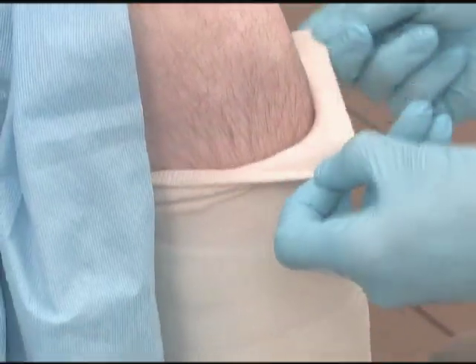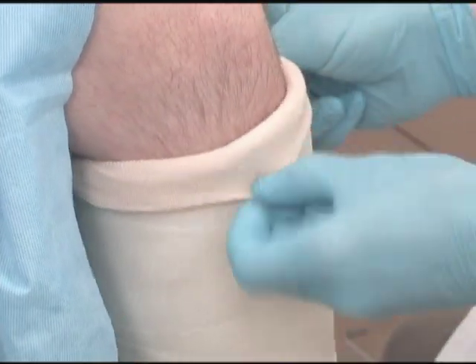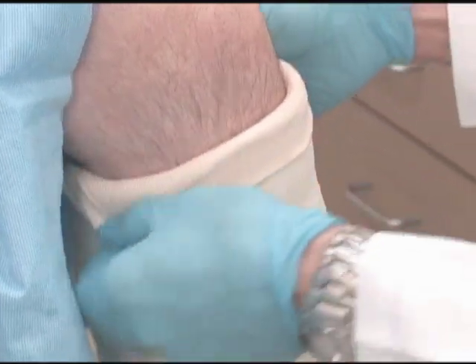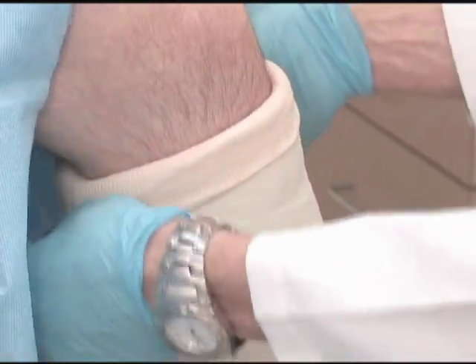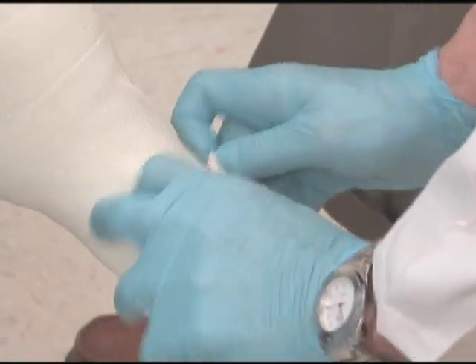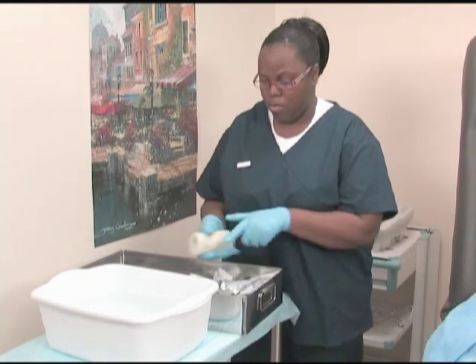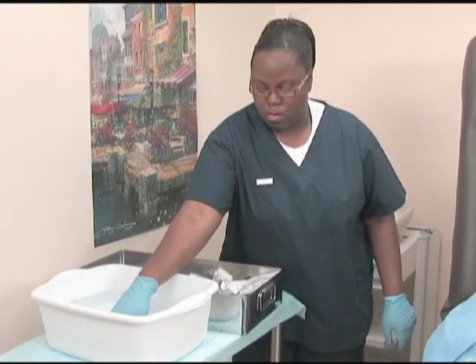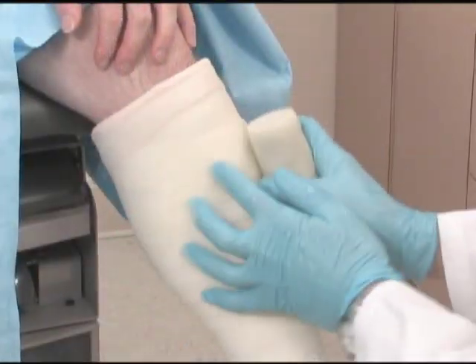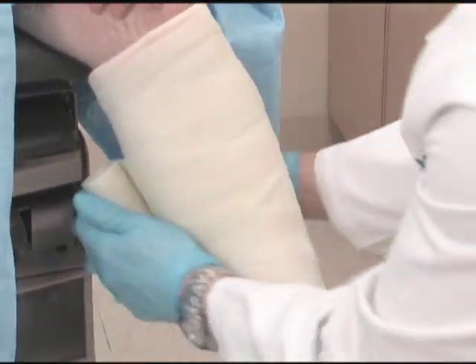When the inner cast is complete, you or the physician will roll the excess stockinette over the edges of the casting material to form a smooth edge. Open another package of tape for the outer cast, soak it, and hand it to the physician. The physician will shape and smooth the outer cast, or may direct you to do so.